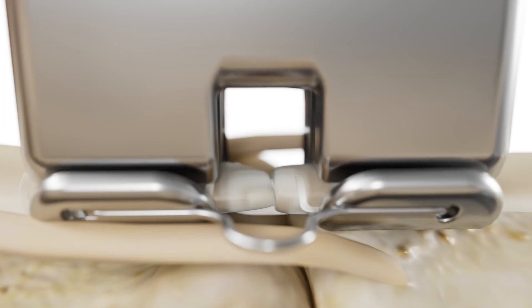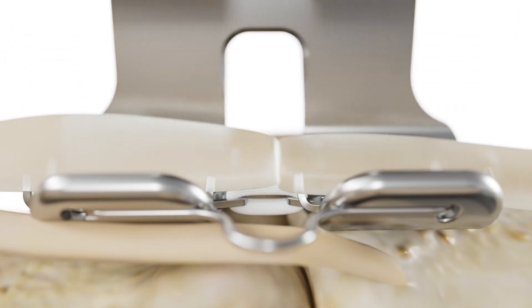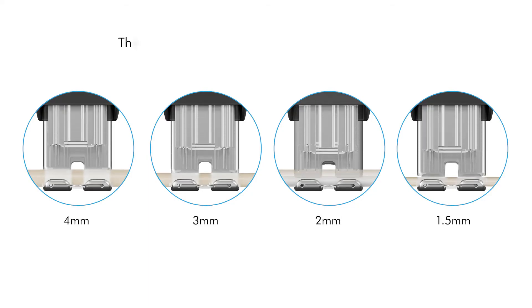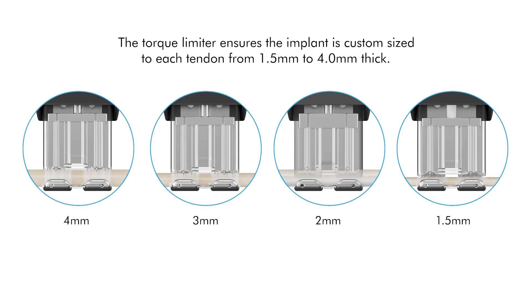The design of the system enables variable deployment of the implant, controlled by the thickness of the tendon being repaired. The deployed implant does not have a fixed height. The legs of the top component of the implant will curl more in thinner tendons or less in thicker tendons, as the implant is deployed and formed together.